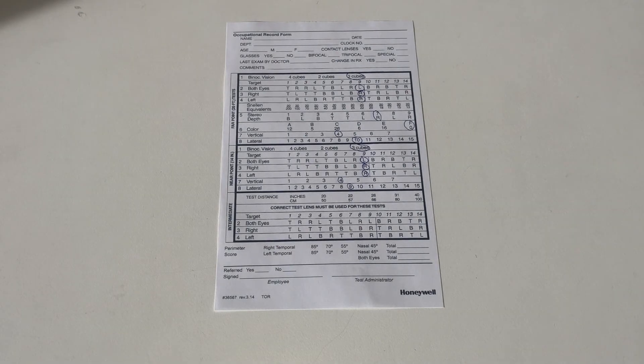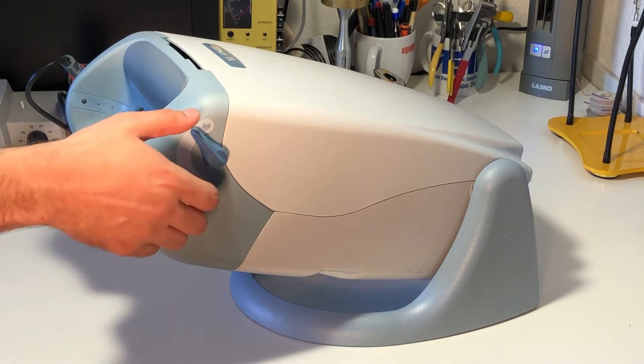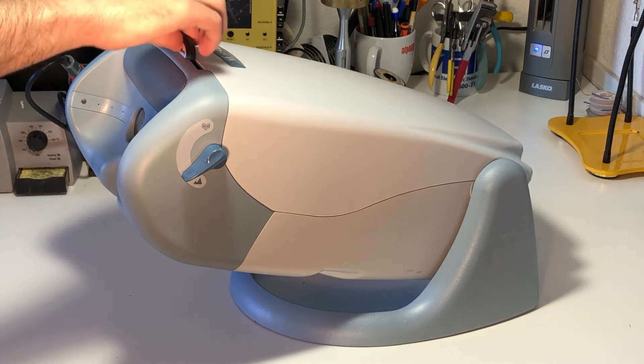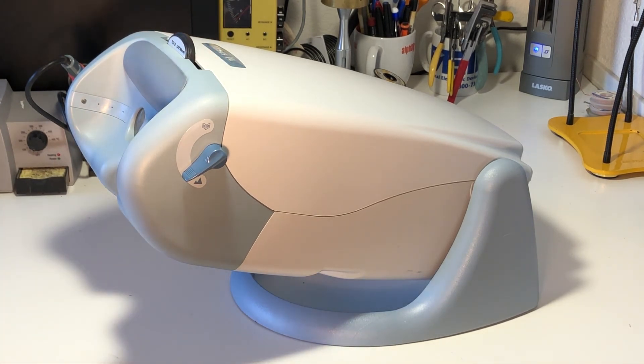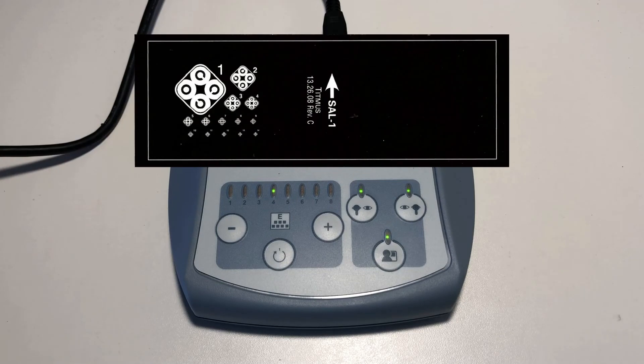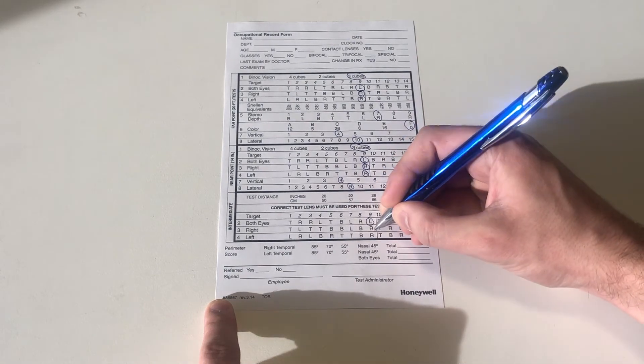Now we will complete the intermediate portion of the test. Change the near-far lever to the far position and slide the intermediate lens into the Vision Screener. Repeat the procedure for slides 2, 3, and 4. Record the results in the intermediate box of the record form.